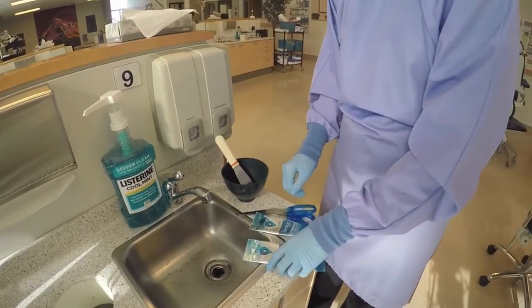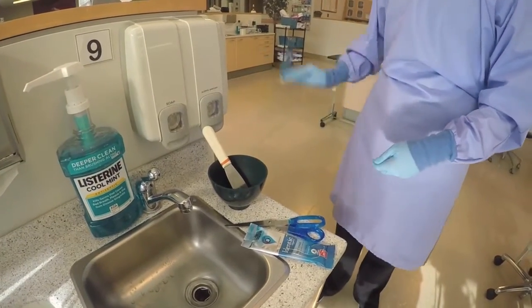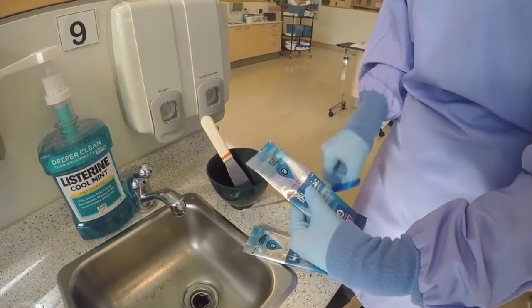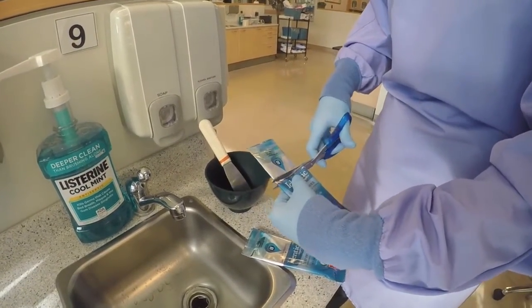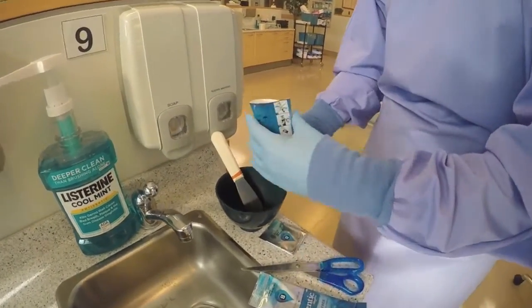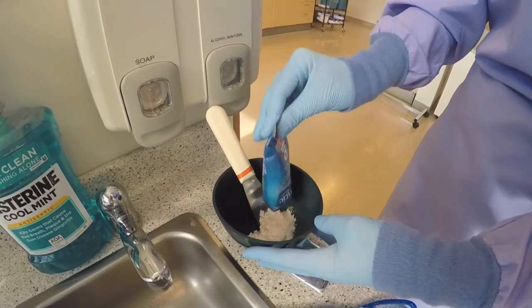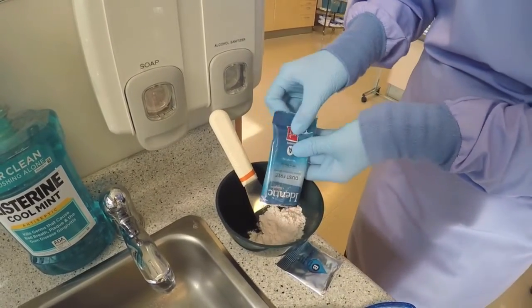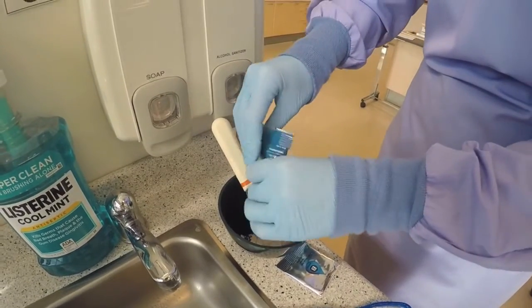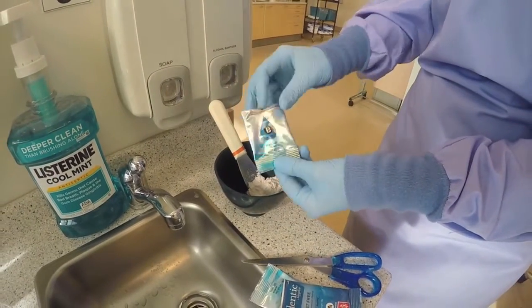You will then begin mixing your alginate for your mandibular impression. Take 1 packet of alginate and hit against your leg. This is done to begin activating the powder. Making sure all the powder is in the bottom half of the packet, cut the packet at the dotted line. Pour the powder in your mixing bowl. Take the empty portion of the packet and fill with cold water.